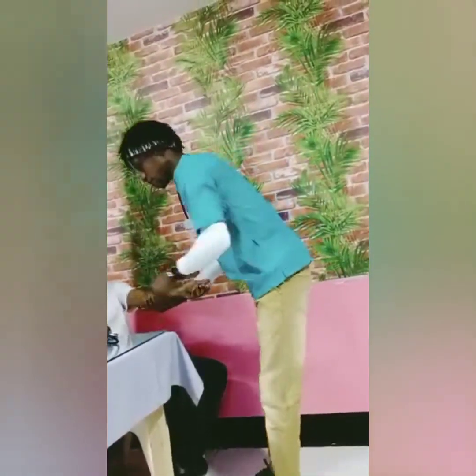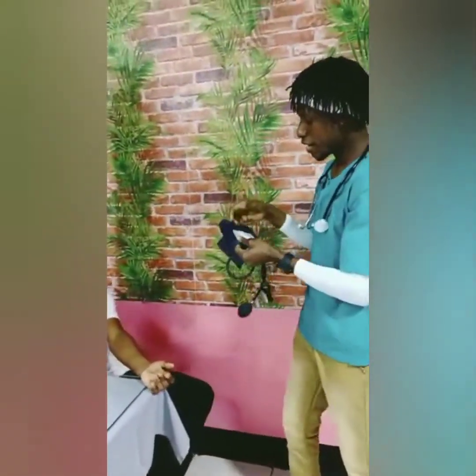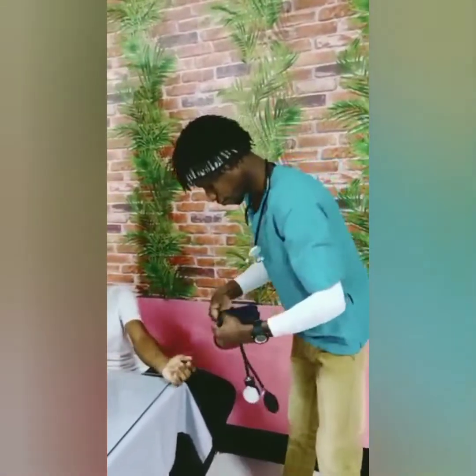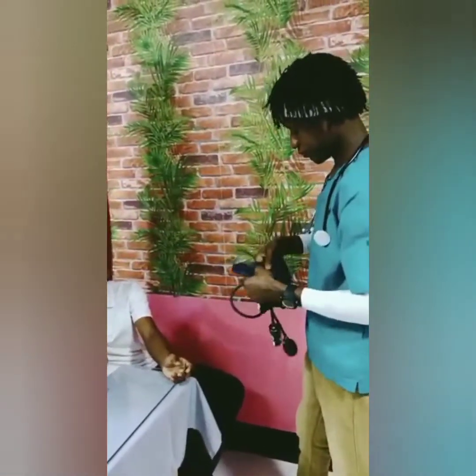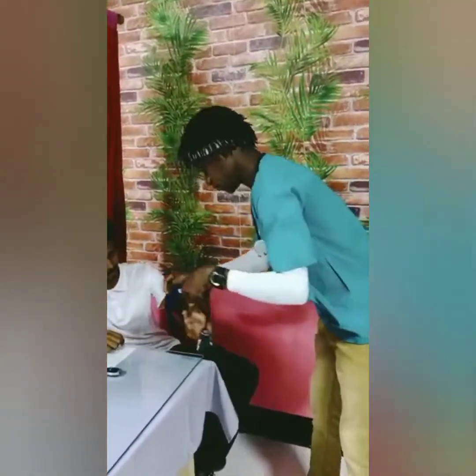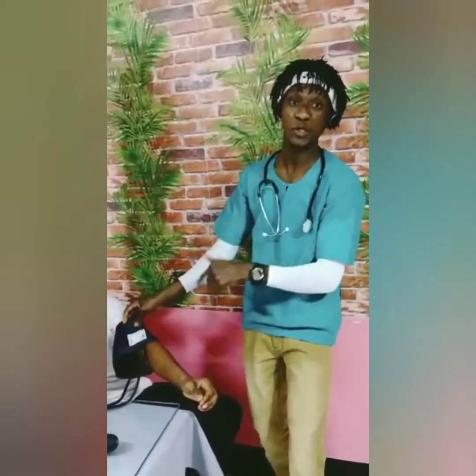This is my cuff, and remember, there is an arrow, for the left and the right. I have to open it nicely. In fact, this looks like Captain America's band.